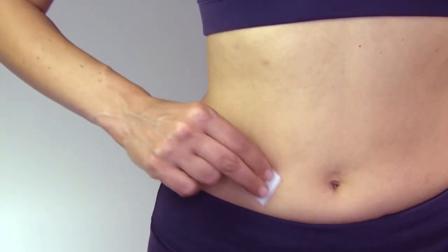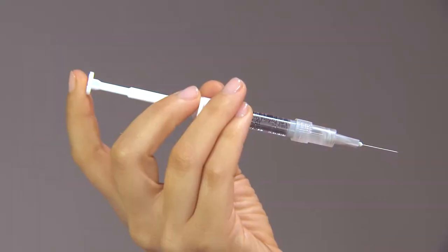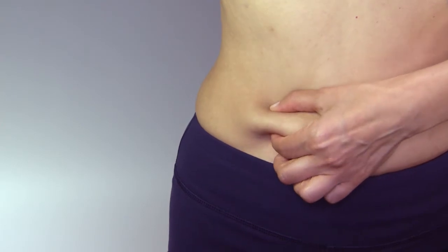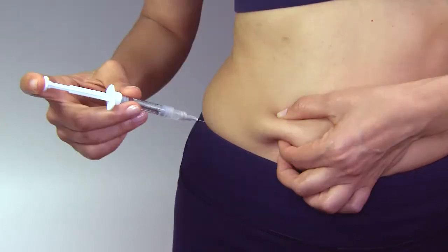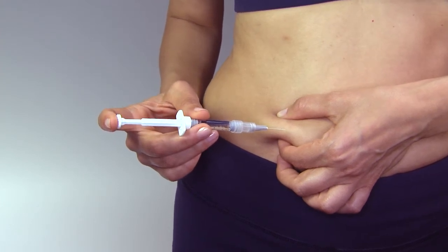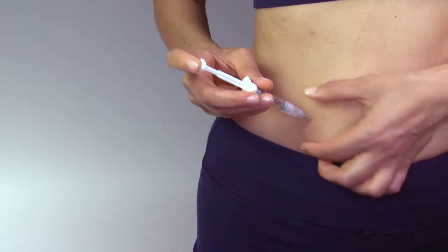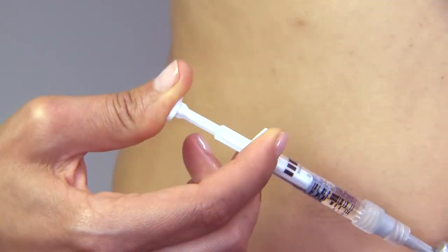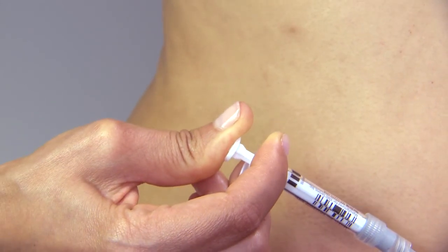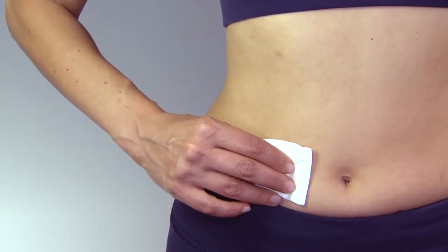Take an alcohol wipe and clean the skin at the injection site and allow it to air dry. Hold the syringe with one hand the way you would hold a pencil. Pinch the skin on the chosen injection site with the other hand. Insert the entire length of the needle into the skin at an upward angle of about 45 to 90 degrees as indicated by your doctor or nurse. Release the hand pinching the skin and depress the plunger in a slow, steady motion until all the medication is injected. Gently withdraw the needle and apply pressure to the injection site using a gauze pad.